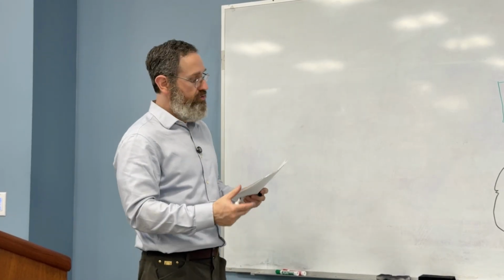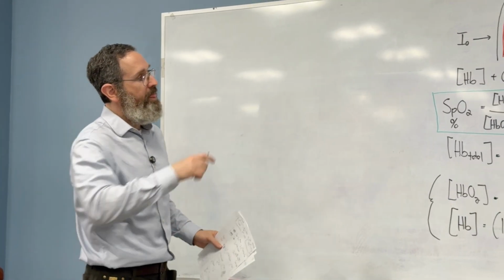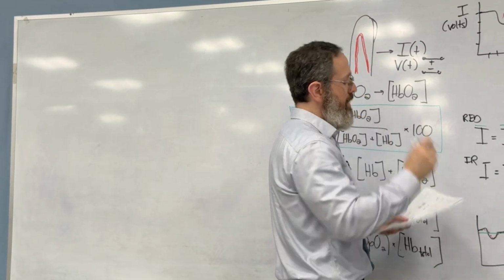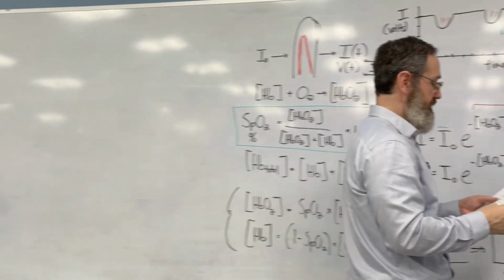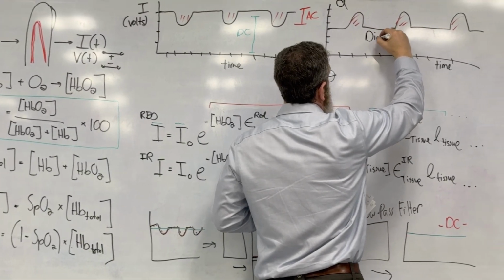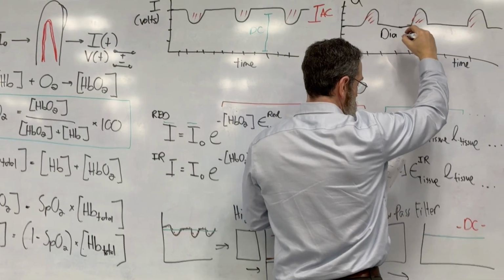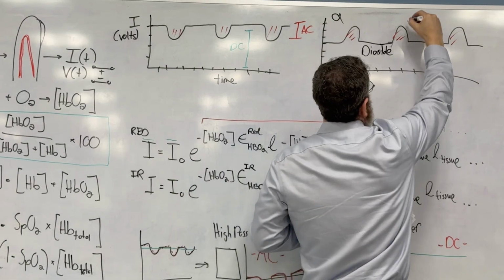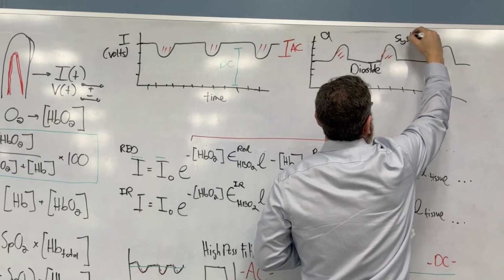So what I want to do first is I want to consider this part here, when the heart is not beating, which is called diastole. And when it is beating, it's called systole.